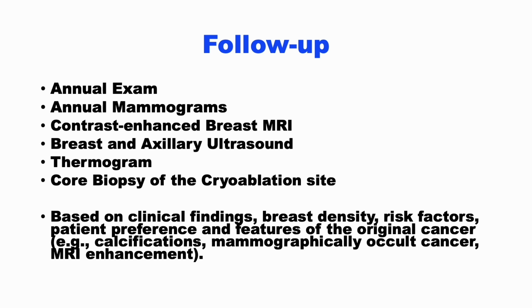Some patients may refuse to undergo mammography and contrast-enhanced MRI due to concerns about radiation or gadolinium exposure, and may require a more customized post-cryoablation imaging routine. Regardless of the regimen, the purpose of follow-up imaging is to detect residual or recurrent breast cancer, which are detected most often in the region or perimeter of the original cancer.